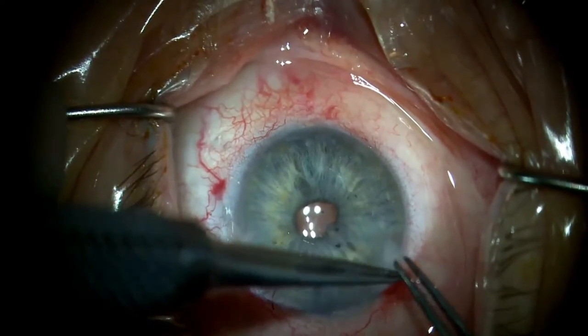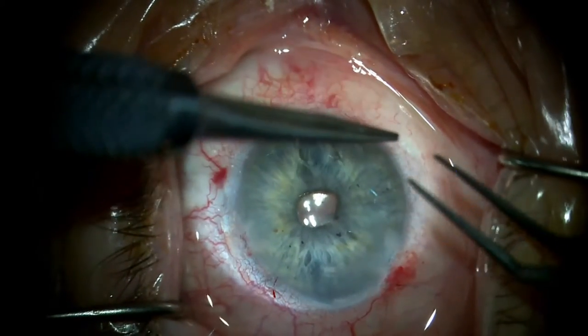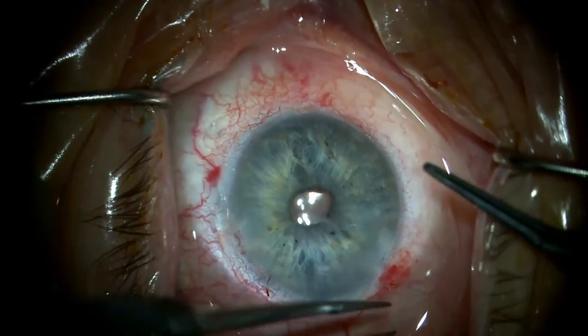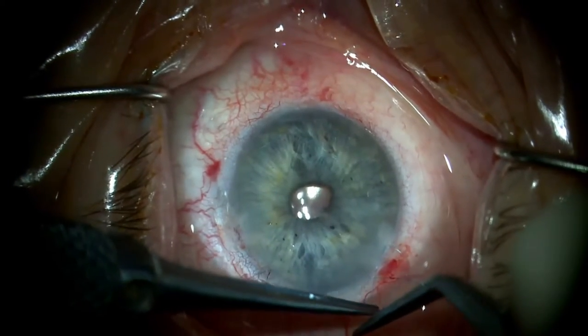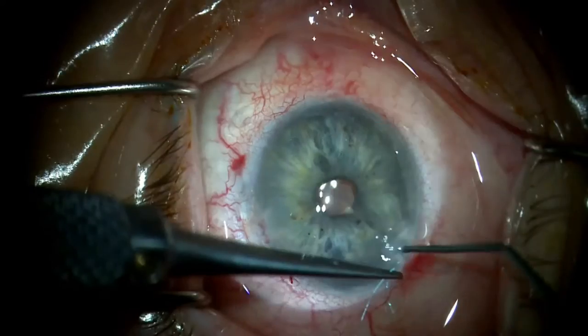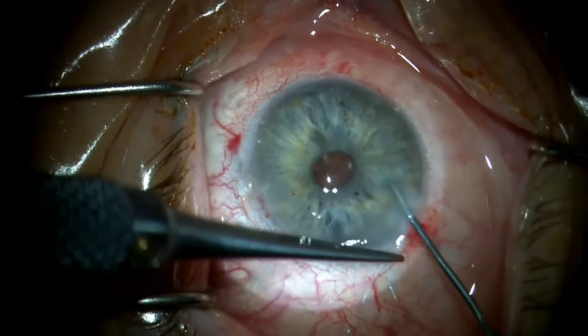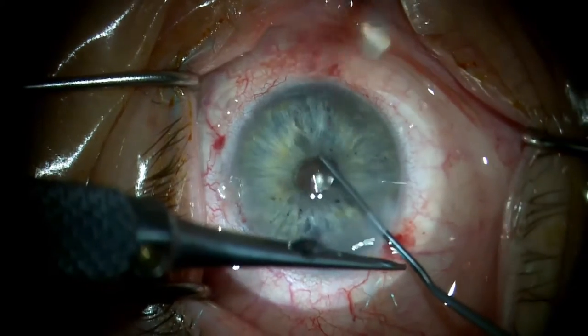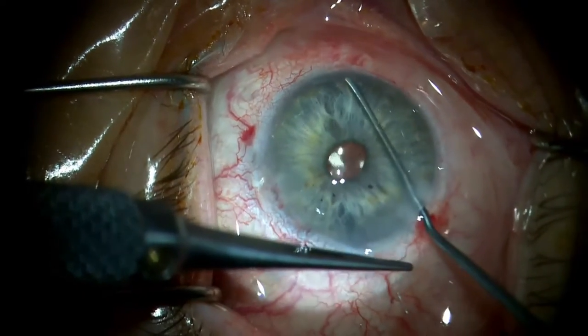The suture ends are tied together starting with a two-wrap throw that is brought down to the outside of the paracentesis. Both suture arms are held by one tying forcep with one suture loop created longer than the other. The IOL manipulator knob catches the longer loop of the suture to take it into the eye and past the desired knot location to tighten the throw.